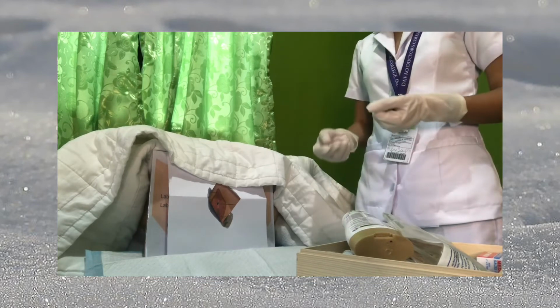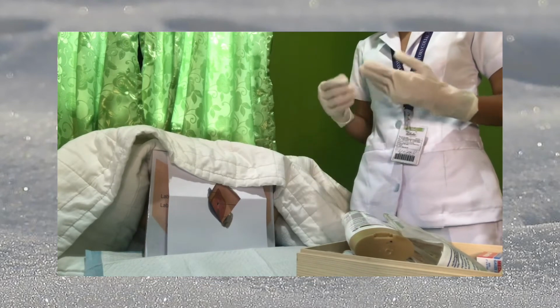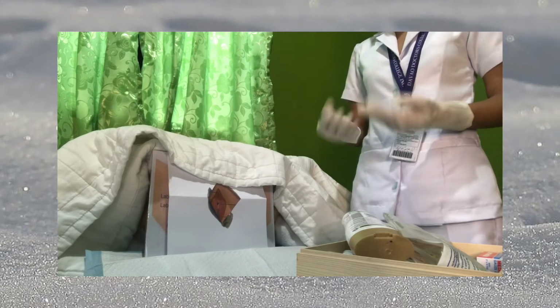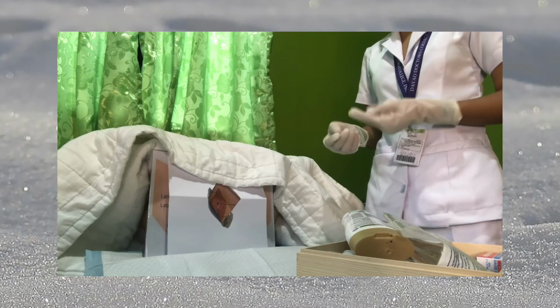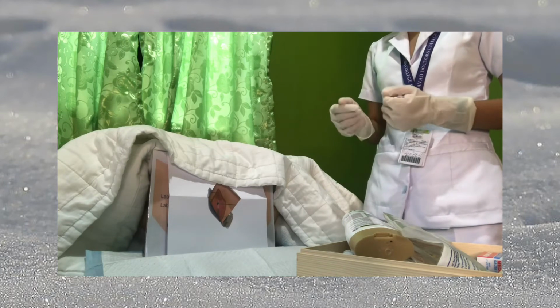Now, let's lubricate the catheter for about 1.5 inches, being careful not to plug the eye of the catheter. The purpose of the lubricant is to reduce friction.